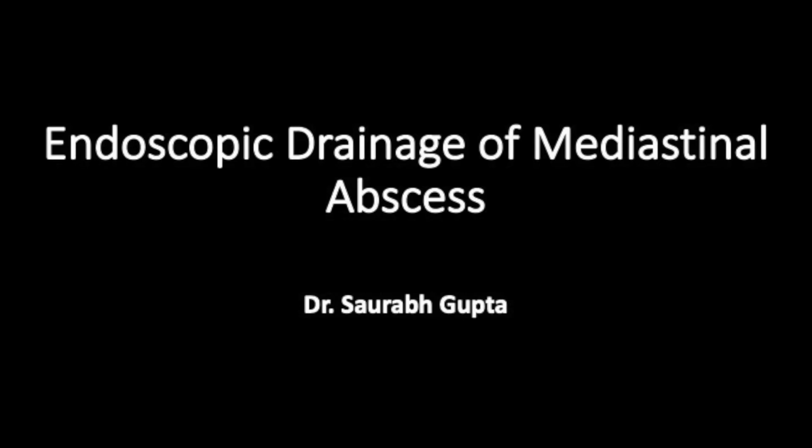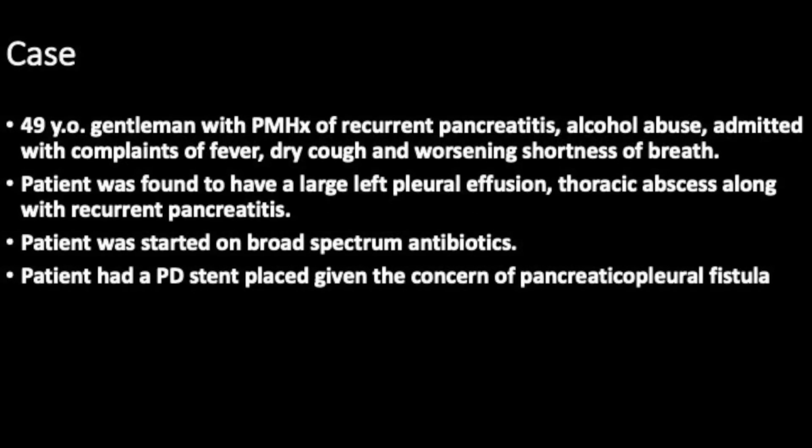This is a case describing the basic concepts of endoscopic drainage of a mediastinal abscess. A 49-year-old gentleman with past medical history of recurrent pancreatitis secondary to alcohol use was admitted with fever, dry cough, and shortness of breath. CT chest revealed left pleural effusion, mediastinal abscess, and recurrent pancreatitis.